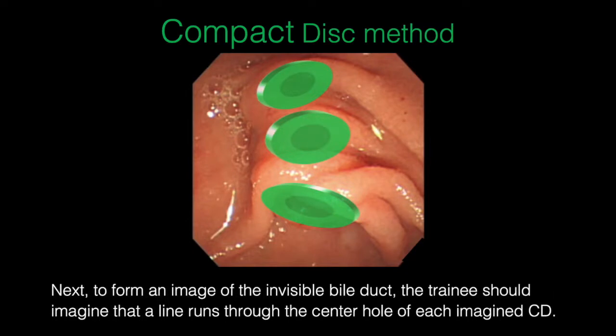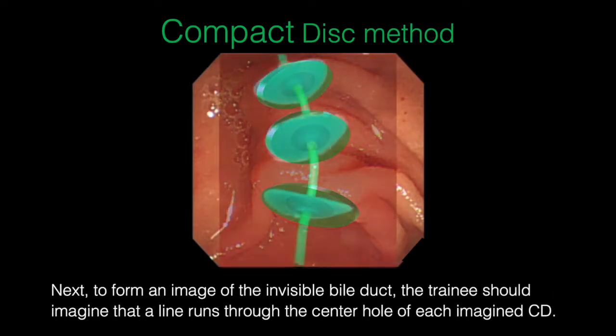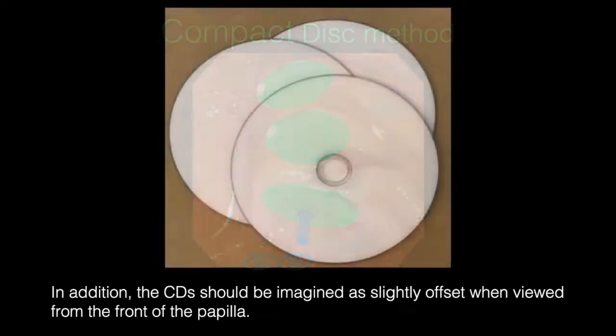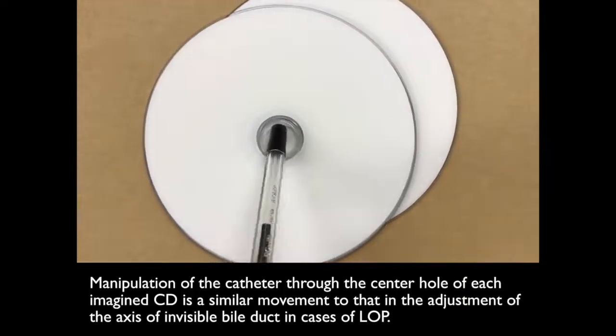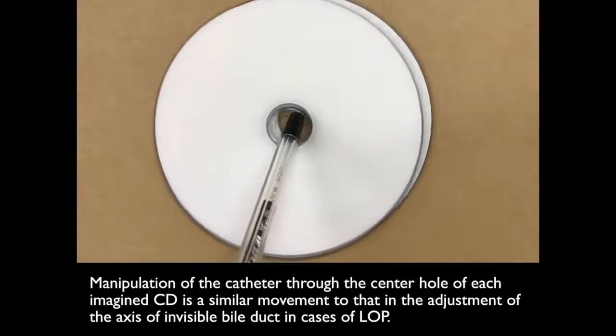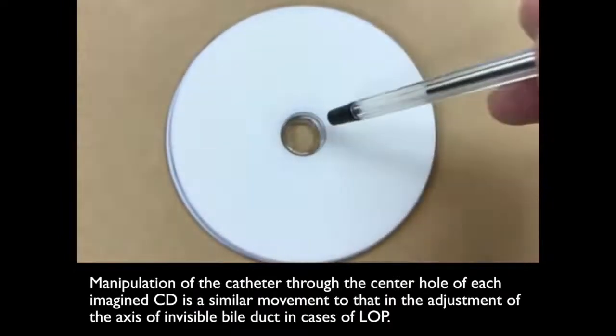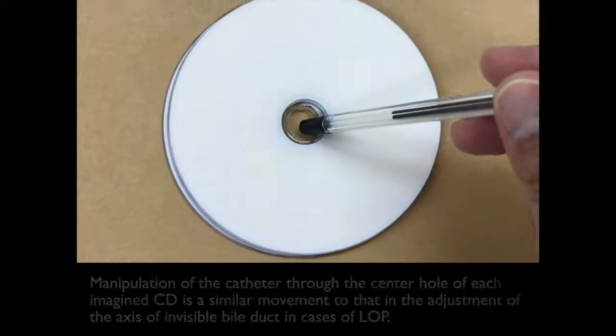Next, to form an image of the invisible bile duct, the trainee should imagine that a line runs through the center hole of each imagined CD. In addition, the CD should be imagined as slightly offset when viewed from the front of the papilla. Manipulation of the catheter through the center hole of each imagined CD is a similar movement to that in the adjustment of the axis of the invisible bile duct in cases of LOP.